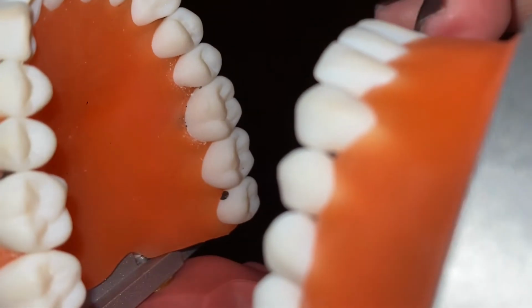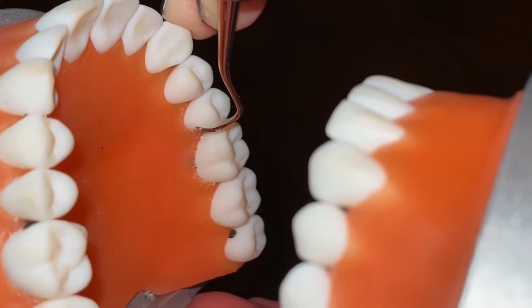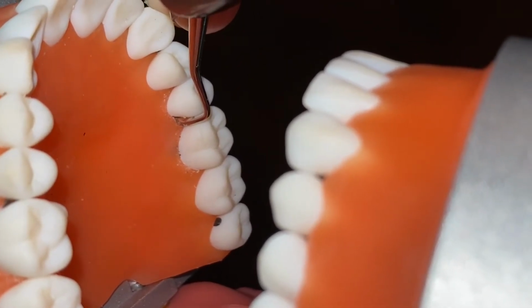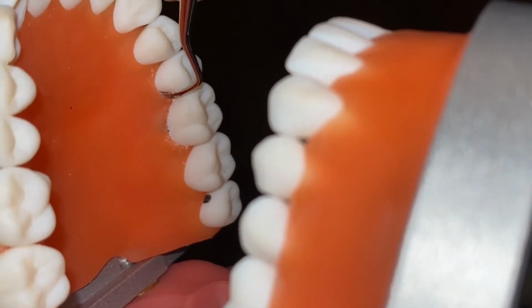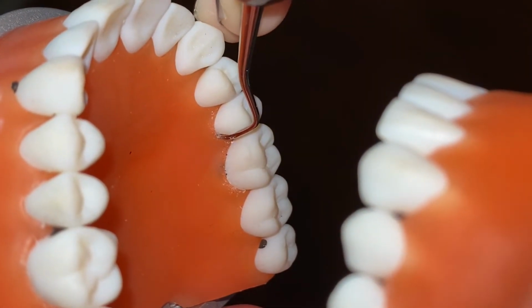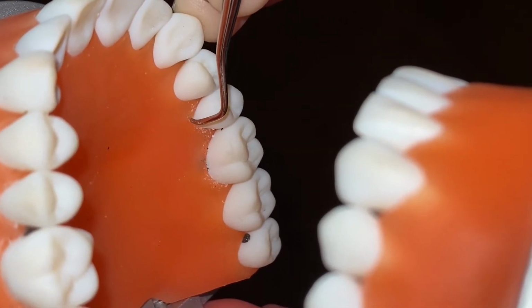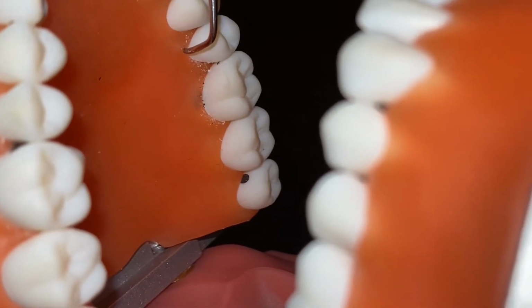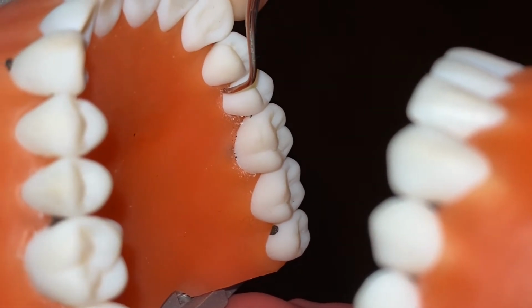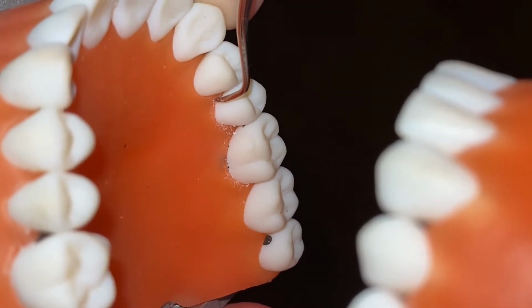Removing the blade, turning your instrument around, and now inserting again, close to 0 degrees as possible, opening up your blade, making sure that the corner of that toe is the one adapted, and then up, down, pivot, up, down, pivot, roll, up, down, and remove.